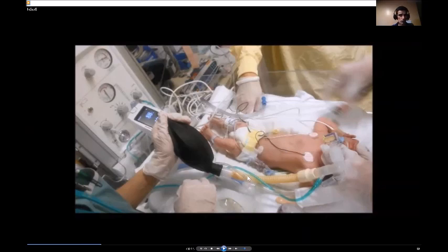You can see we use the flow inflation bag — there is no valve, and the respiratory therapist is holding the valve by hand to control the pressure inside the bag. I am holding the ETT and looking at the colorimetric changes of the CO2 detector.